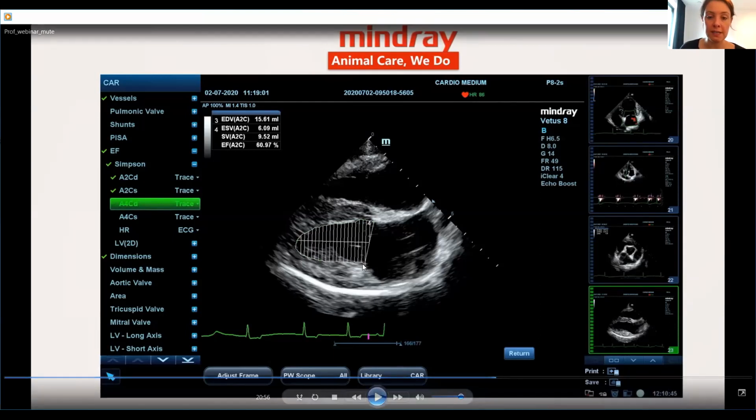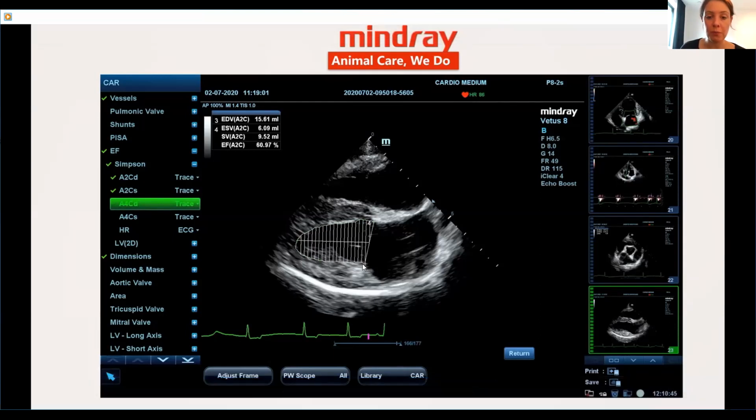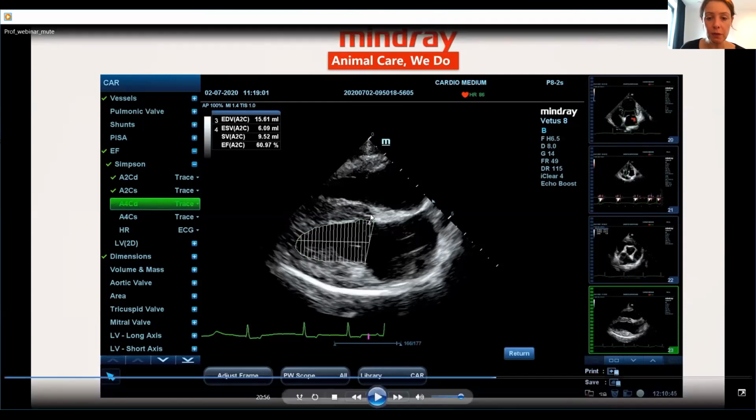So there's basically 3 points that are very important. Point 1, don't go too far, don't go actually beyond the mitral valve annulus. So you orient here on the mitral valve annulus. Second point, you need a long ventricle. Third point, you need good delineation of your endocardium. And with that, I also mean that in systole, you will have to probably cut out the papillary muscle.